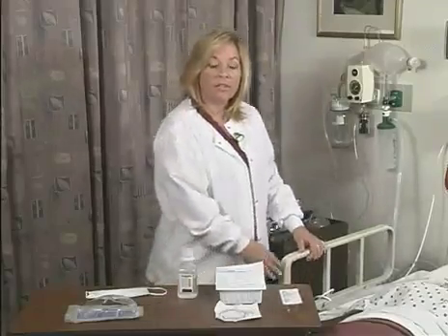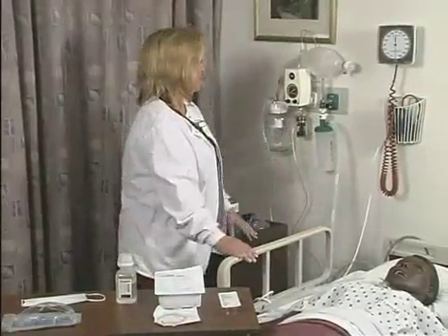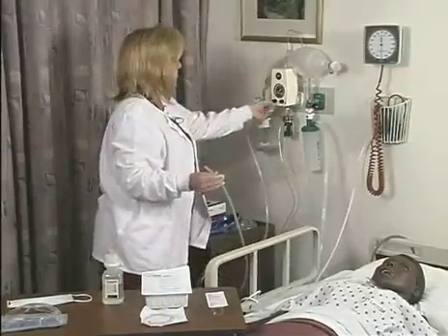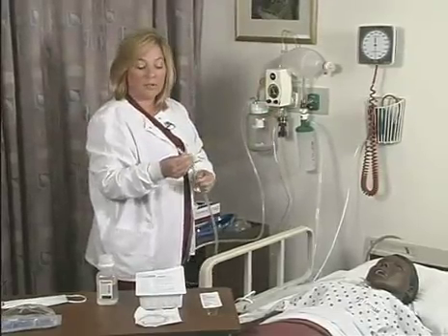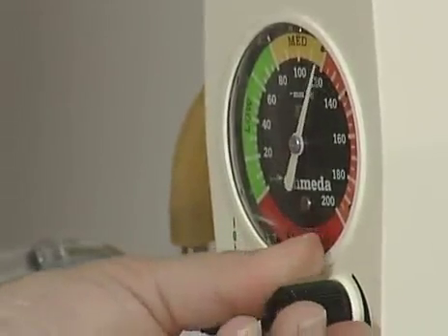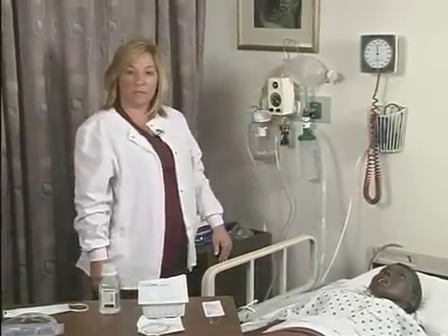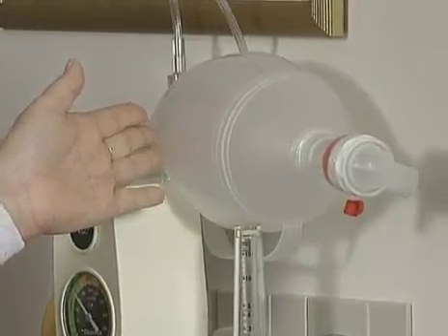The other equipment that you want to assess and make sure is working properly is your oxygen source connected to your patient, and your suction equipment. Your suction equipment should be between 80 and 120 millimeters of mercury. To check that, you would occlude the suction and look at the manometer and adjust the suction between 80 and 120. The other equipment you would need to have available is an Ambu bag if you would need to ventilate the patient prior to the suctioning procedure.